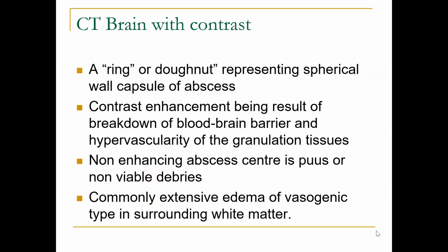So the contrast enhancement is a result of the breakdown of the blood-brain barrier and hypervascularity of the granulation tissue. The non-enhancing abscess center is pus and non-viable debris.